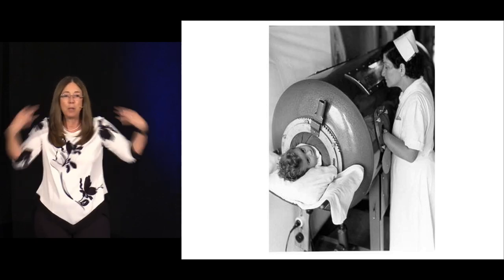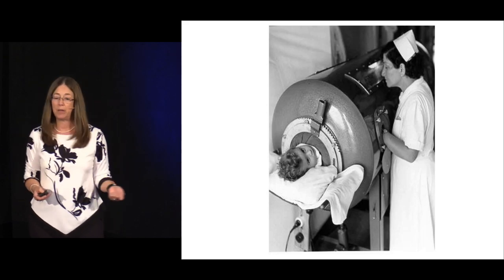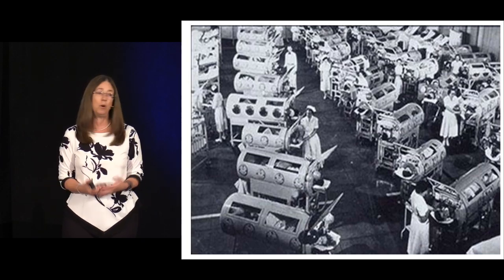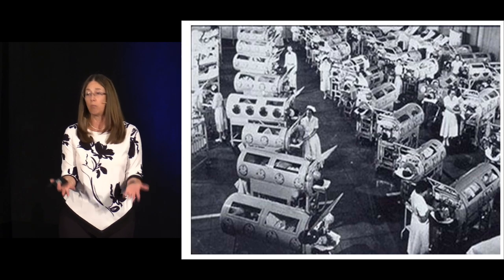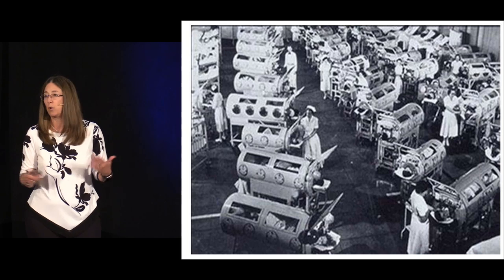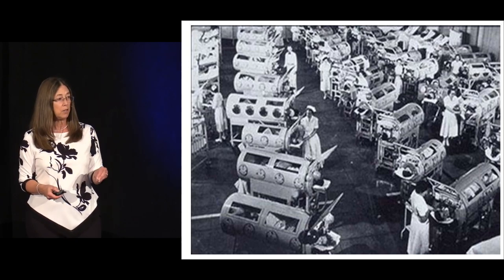This is all in the body. The lungs are inside this thing, and pressure is pumped in and out, and that's how they breathe. They used to have rooms full of people with this. If you don't believe in vaccination, I'll tell you, this is what the polio vaccine got rid of. This was rampant. It was just terrifying back in the 30s, 40s, and 50s. This was a terrible thing. This is negative pressure ventilation, though.